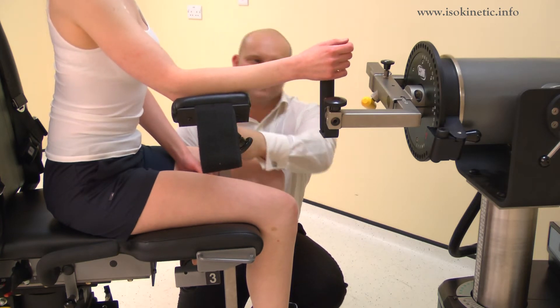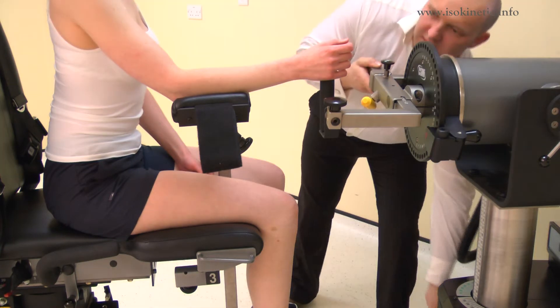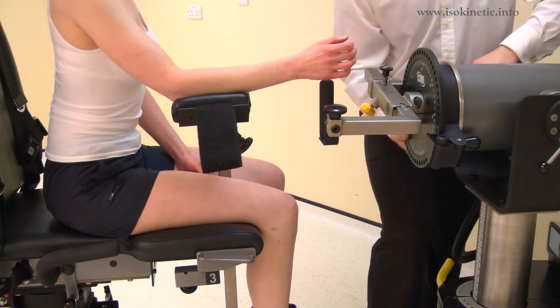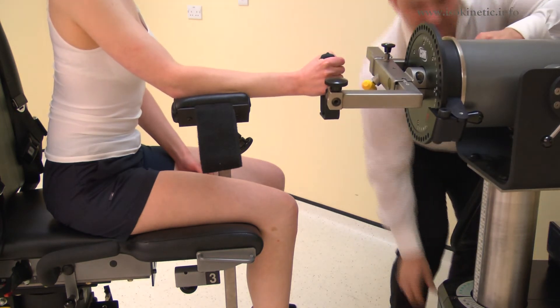Top tip: 90 degrees is the desired angle for the elbow. The chair fore-aft and/or monorail may need adjustment to achieve this position. Now adjust the dynamometer height so the black dot on the input arm is opposite the middle of the hand.